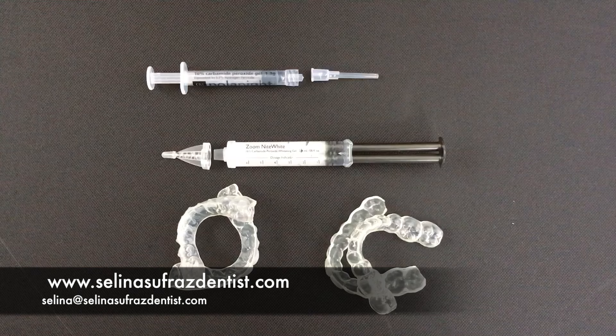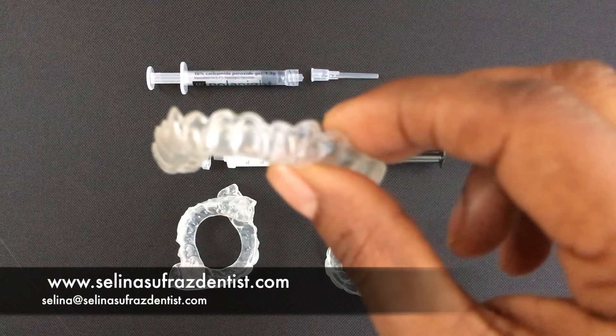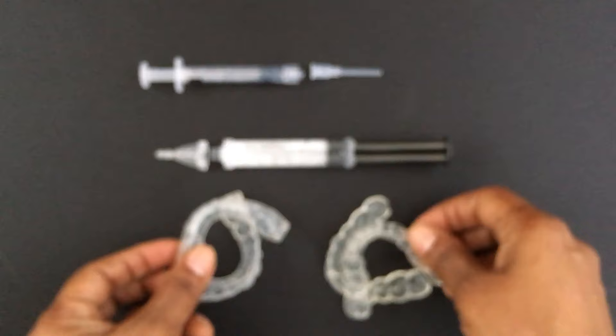When you get your custom-made trays from your dentist, first of all dry the trays before you use them. There are two types of trays. You might get one which is like this, where you have scalloped curved edges that follow the gum line with reservoirs within which you can't actually see. Or you might get these, which are straight across with small little indentations along the teeth where you can see where to put your gel.